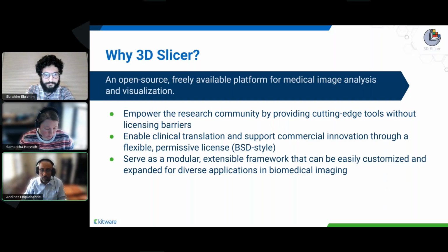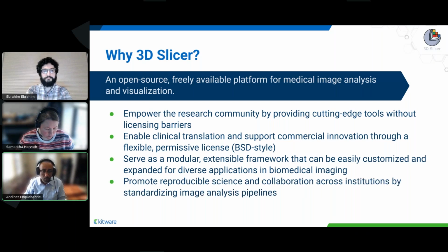So there are a lot of modules available. It's extendable. It can be customized and expanded. Also, it's heavily dependent on open source libraries under the hood, like ITK, VTK, and CMake, which makes it a lot easier to do reproducible science. So you'll be able to generate results and share them with your colleagues, and they will be able to reproduce the results that you've got.